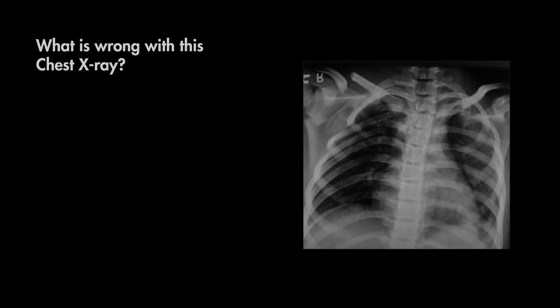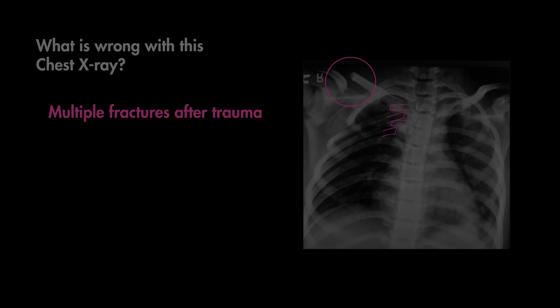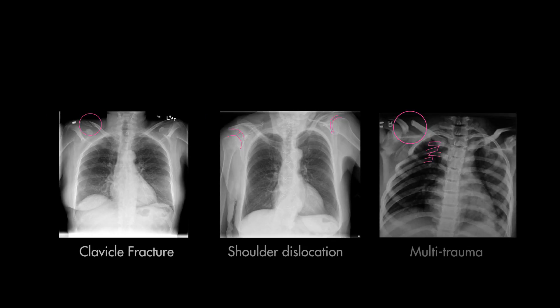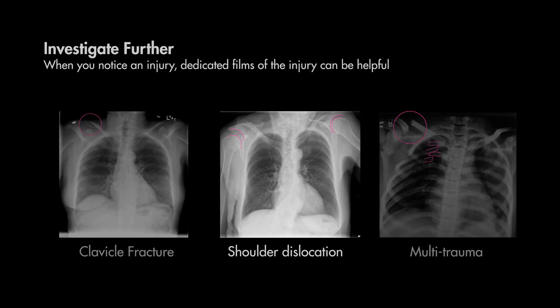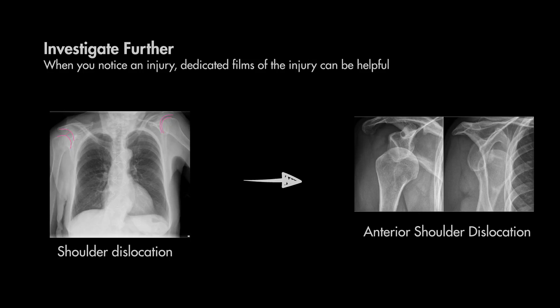Some x-rays are a little more obvious, like this one, which has both rib and a clavicular fracture after trauma. For a lot of these fractures that you catch on chest x-ray, there are also dedicated films that you could get of the affected bone or joint, which is often necessary to get the appropriate views to determine the extent of the injury, like you see here in this dedicated shoulder x-ray.